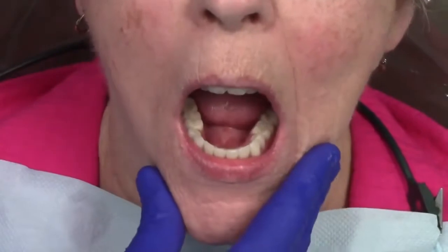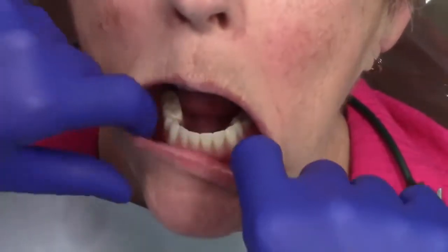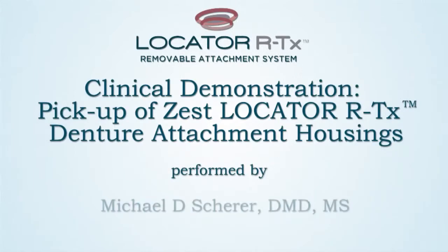It's important to understand that we should test the retention and stability by using our fingers in a back and forth motion as well as the patient up and down. This has been a clinical technique demonstration of the pickup and attachment processing procedures for Locator RTX.